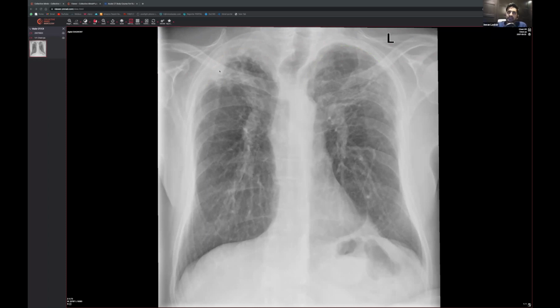And the thing is, there are actually quite a few different diagnoses for apical fibrosis. TB can be one of them. Another could be sarcoidosis. Yeah, exactly. It could be massive fibrosis as well. It could be because of exposure to something like beryllium and that kind of thing as well. So it's important to know that, yeah, you could say TB, but this patient has shortness of breath and it looks like apical fibrosis, which can be a result of multiple things.